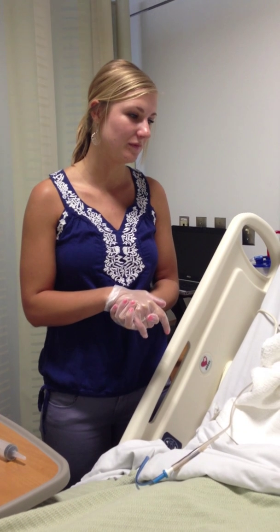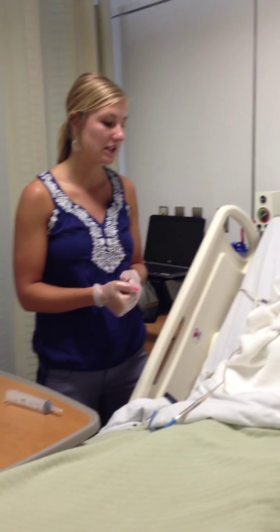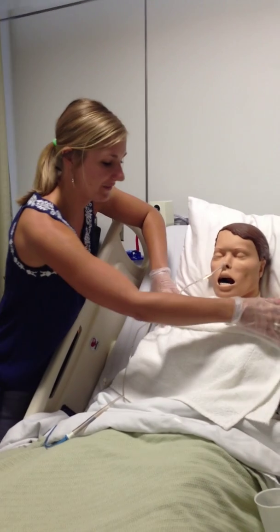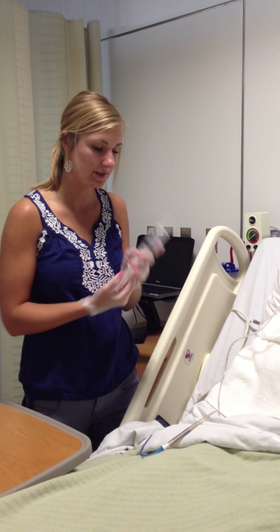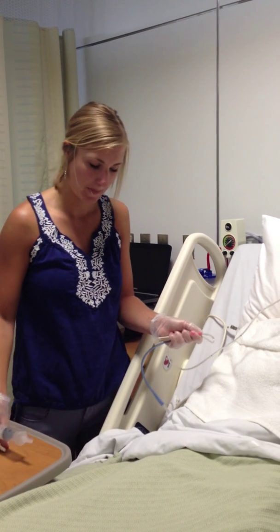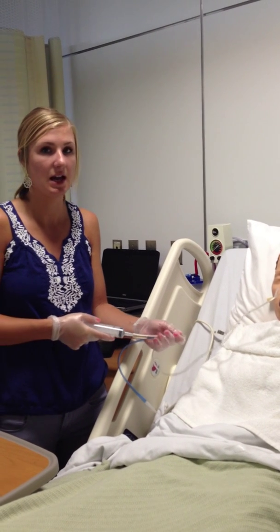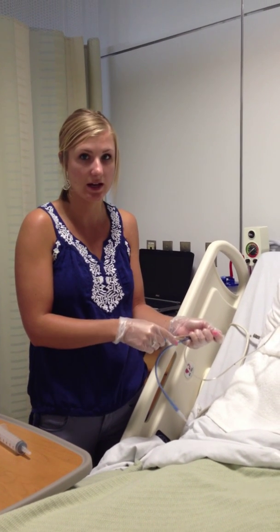Next, we're going to discontinue the NG tube. Again, I'd gather all my supplies, introduce myself to the patient, ID them, check the patient's orders, and make sure the bed is in the right position. I'll explain that this procedure is a lot less invasive and a lot easier. Pretty much, we're going to first inject 30 cc's of air — kink our tubing, pull our cap, and insert the air. This clears the tubing of any residual fluids that have accumulated, so it's a little less messy pulling the tube out.